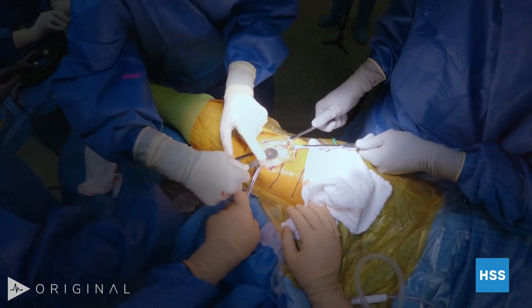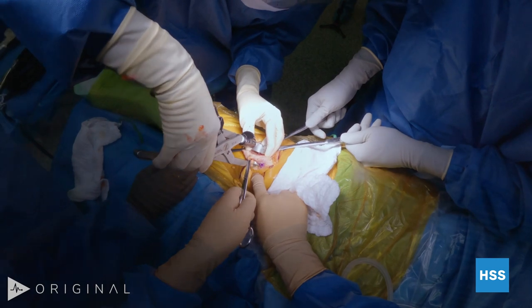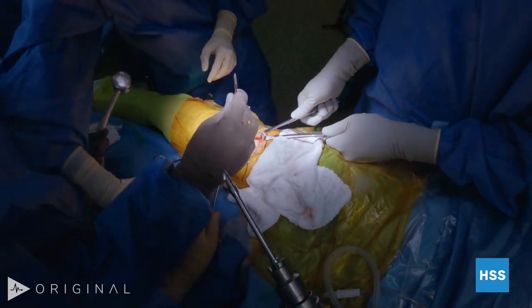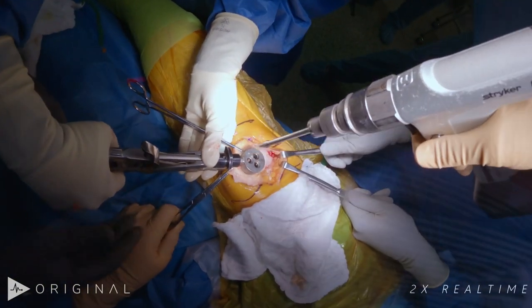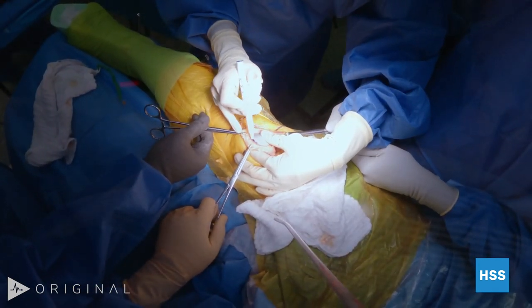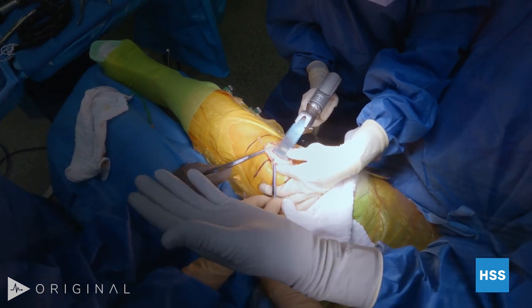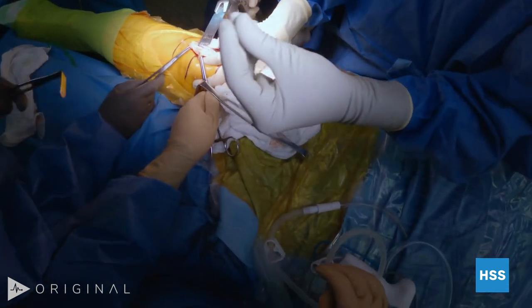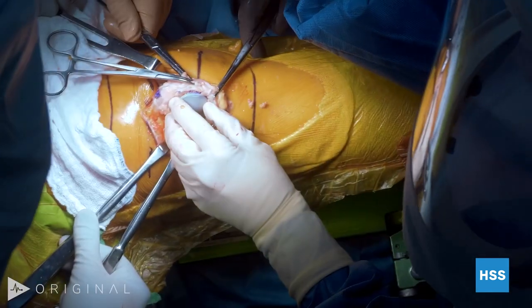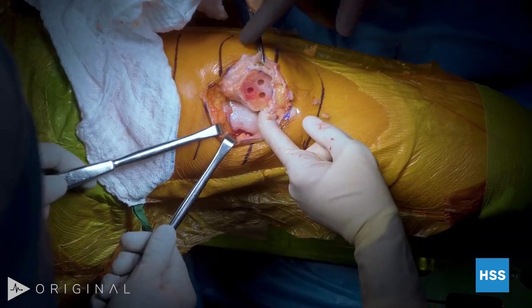We're going to take off a nice big chunk of the lateral side. What you can do here, which is really nice, is get to the lateral side and do as much of a lateral facetectomy as you can. So all of that's going to go — that's the facetectomy. We're going to take off this bone, which is the lateral facet. It's a little challenging because we just tried to preserve that lateral side. We'll use a bovie because I don't want to violate what we just tried to preserve — sometimes you end up with a hole in what you just tried to preserve. That's it for the patella.